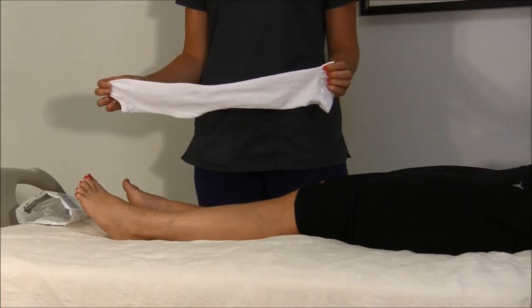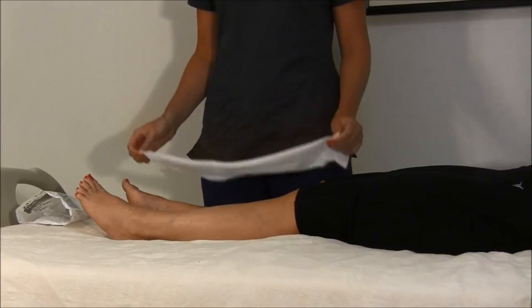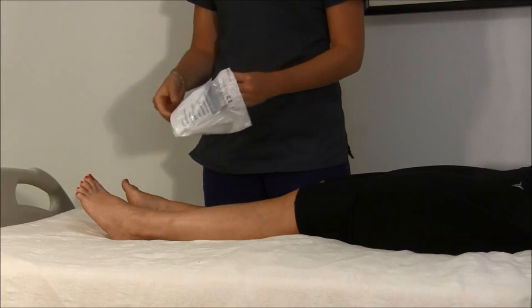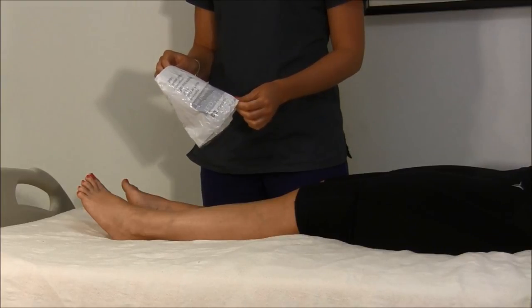To put on the compression stockings, you will need help from another person. Use a plastic produce bag, a newspaper bag, or a sandwich bag when putting on the compression stockings. Make sure the legs are dry. Corn starch or baby powder may be helpful.